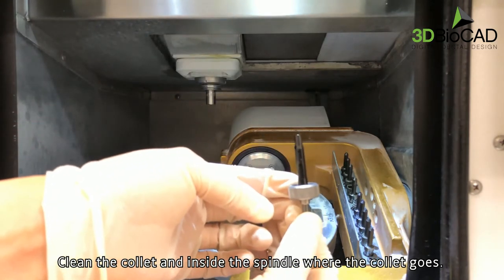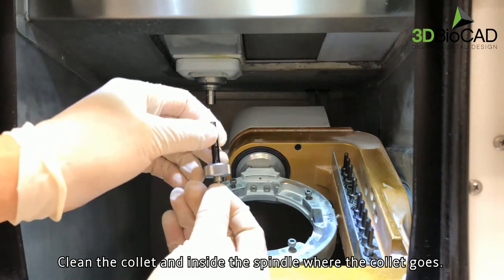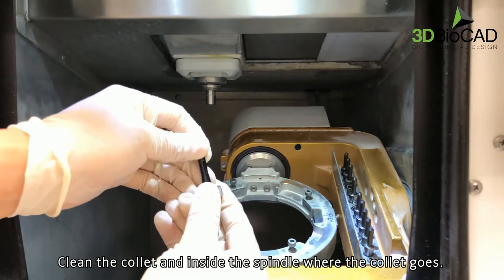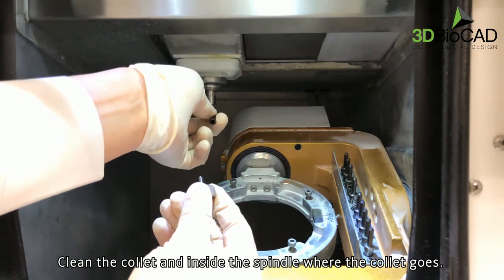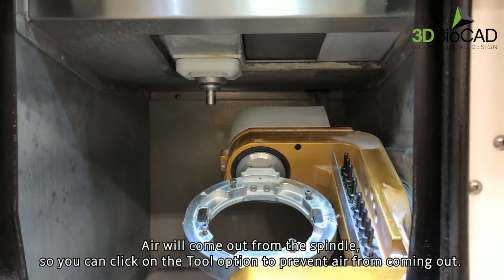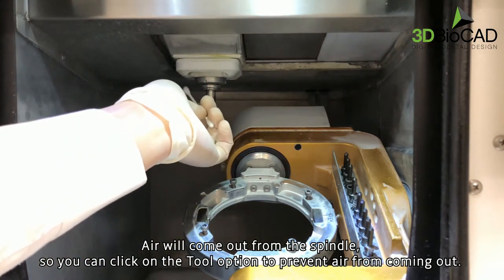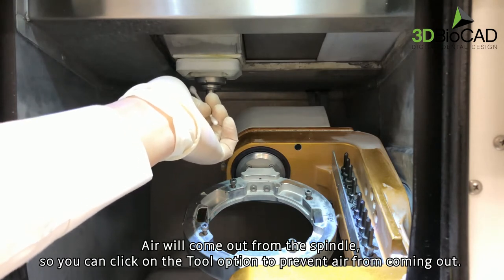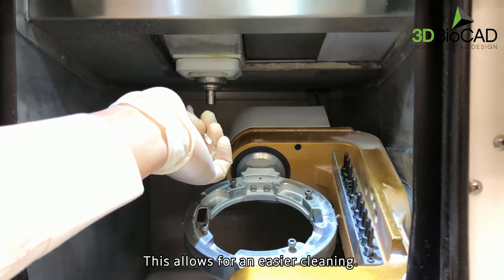Clean the collet and inside the spindle where the collet goes. Air will come out from the spindle, so you can click on the tool option to prevent air from coming out. This allows for an easier cleaning.